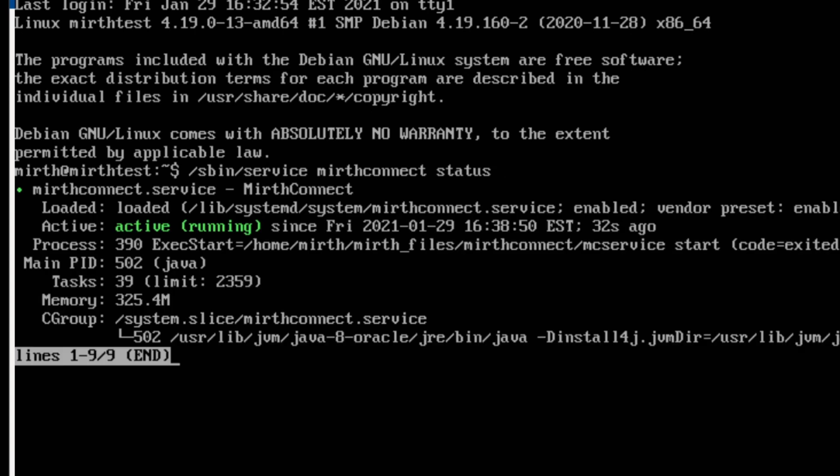And you can see here that it says the service is active running, which means that, like you imagine, it is running. And we didn't have to restart it manually like we would have to before.